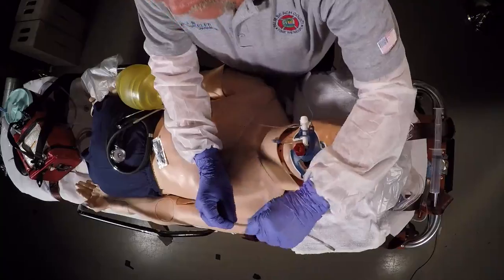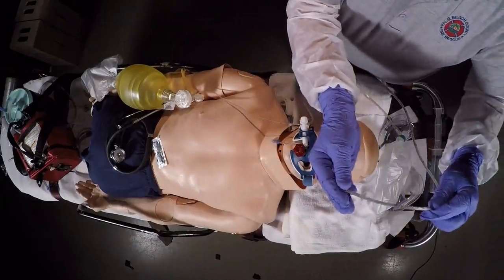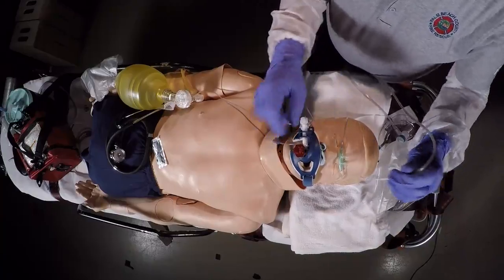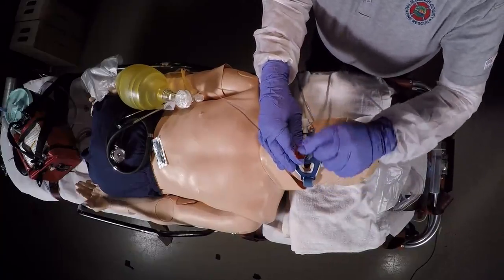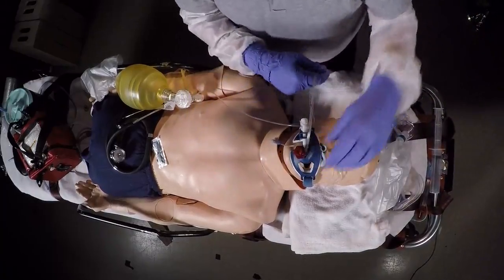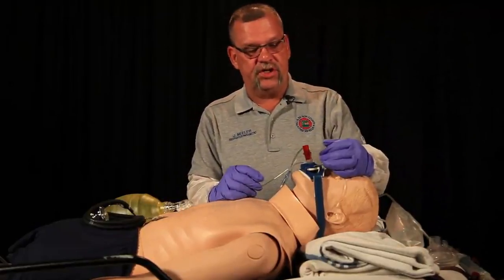This patient measures at 50 centimeters, and the one thing that we can do here, you have to vigorously, aggressively lubricate this gastric tube. Back here on the back side of the King LTD-S Airway is the gastric port, and you can go ahead and insert the gastric tube right in here into the King Airway, and advance it to your pre-measured distance. This patient measured at 50 centimeters, and now you have gastric suctioning available to you to relieve gastric distension should that be required.